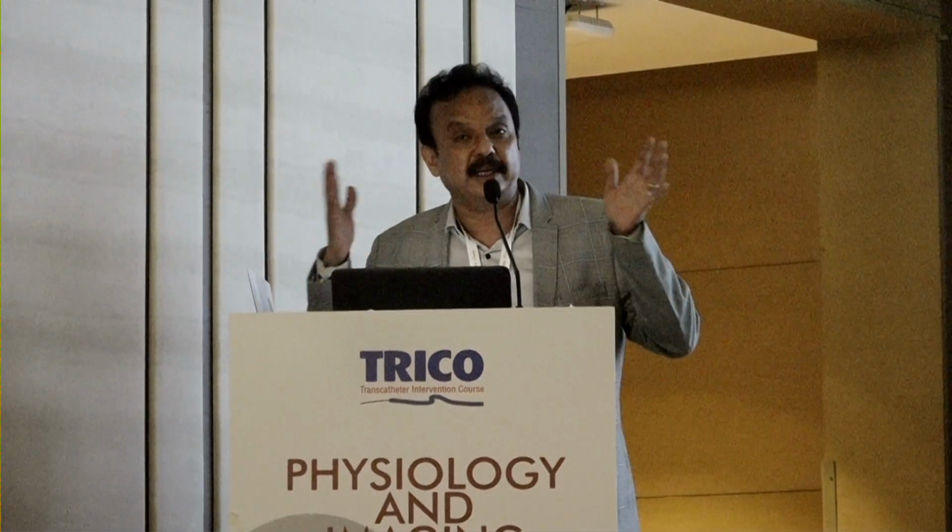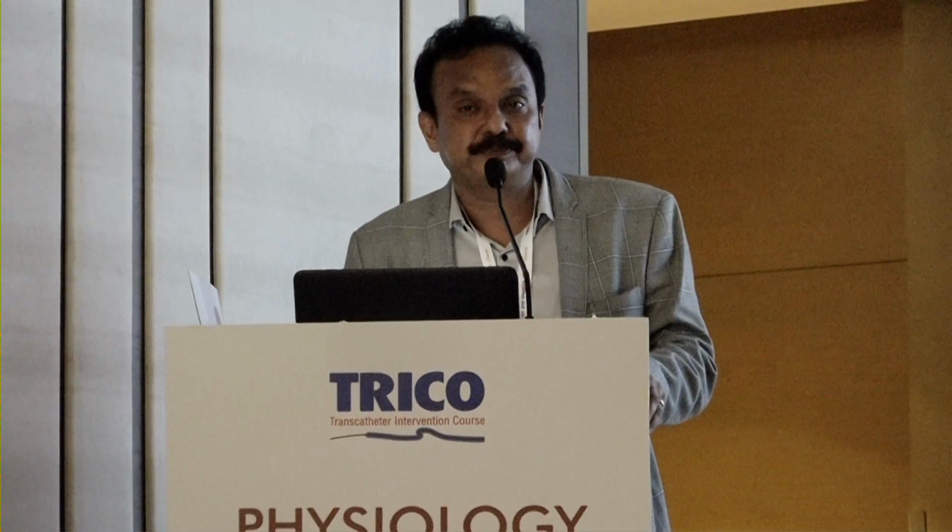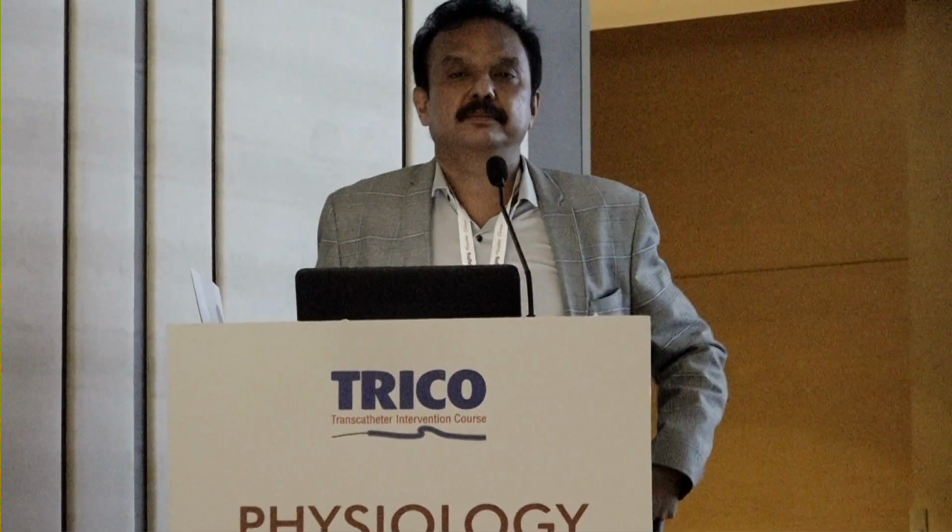Don't over dilate. So just come out of the acute crisis and then decide. I think last comment from Abhiram, because I think Mayo Clinic has done a good amount of work on SCAD and its management. Yeah, I can't take the credit. Dr. Gulati has done most of the work there, but we are one of the referral centers. I think you've covered everything.